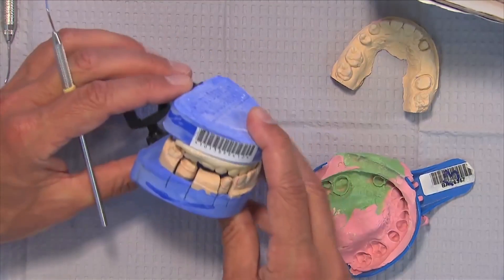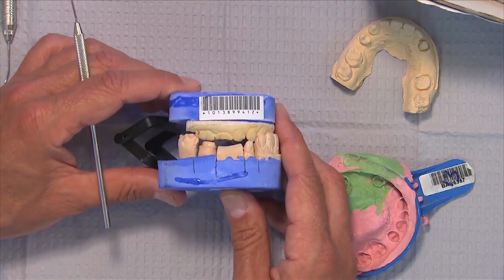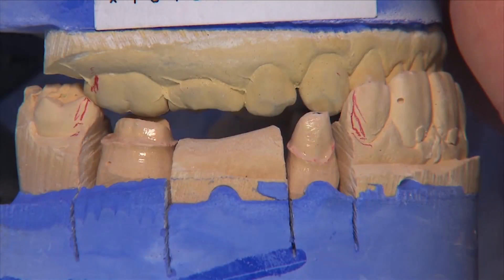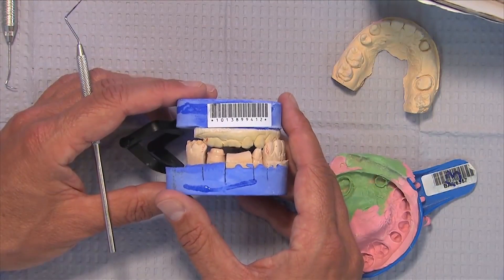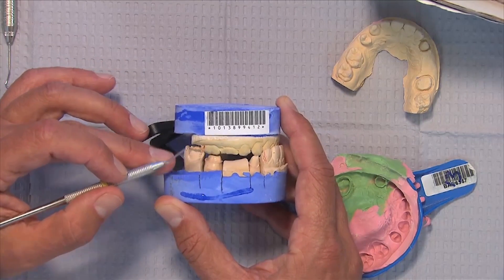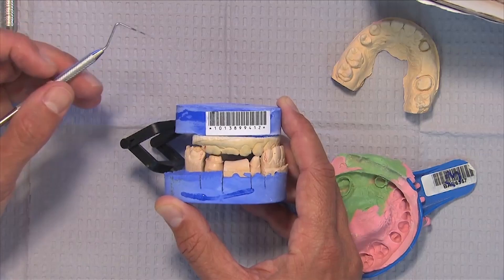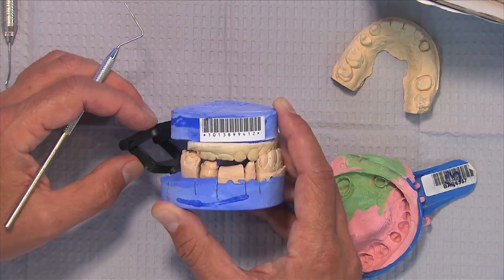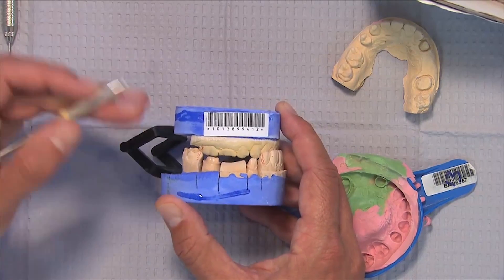Let's take a look at the articulated model and see how this bridge preparation looks. On the molar we've got some limited occlusal reduction — it's a little tight, right about on the occlusal surface, right about under a millimeter, approximately 0.9 millimeters. When it comes to the bridge, what we're really looking for is the connector size. If this was a single unit crown we could probably make this work, but the Bruxer material and other high-strength cementable all-ceramics have an issue when we come to a bridge.